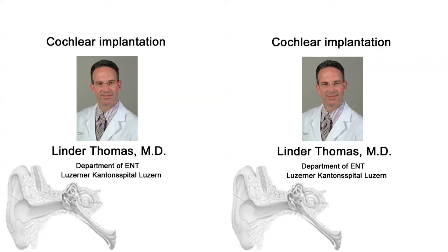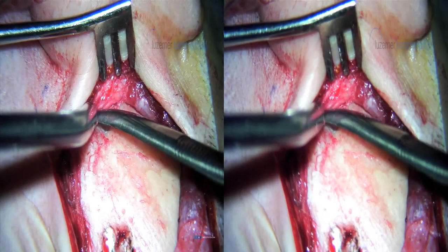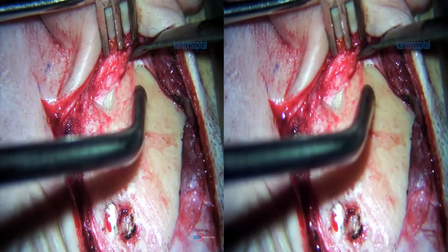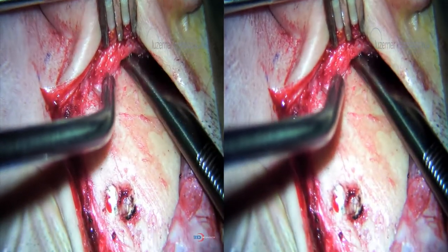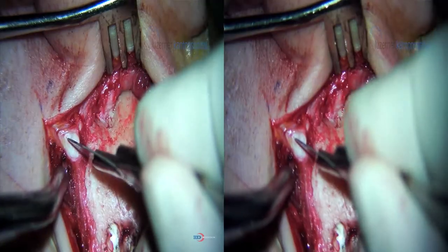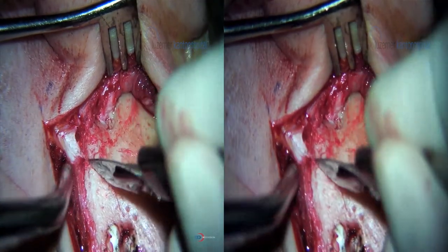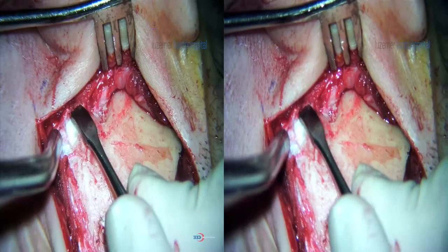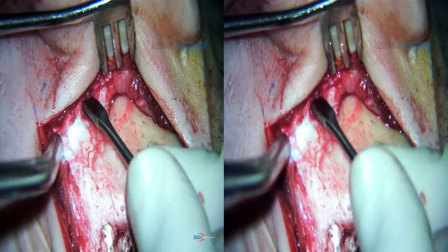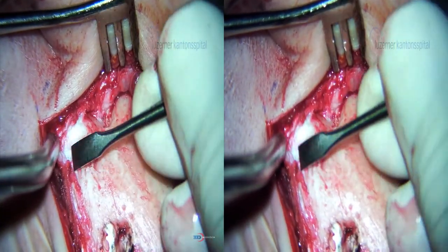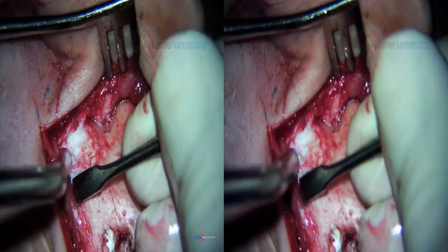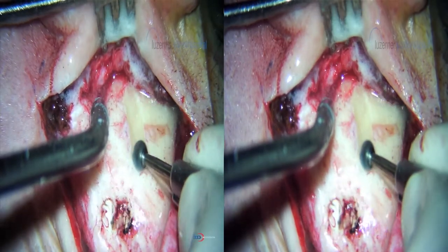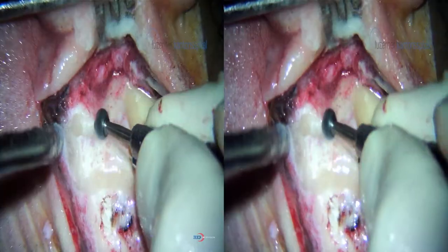We present a short video on a left ear cochlear implantation. An L-shaped incision has been made as well as a periosteal muscular flap. The mastoid is exposed widely.